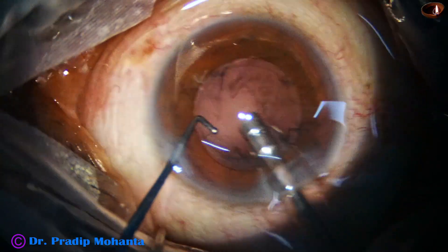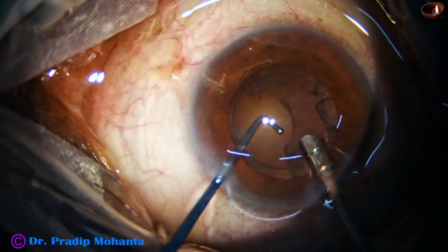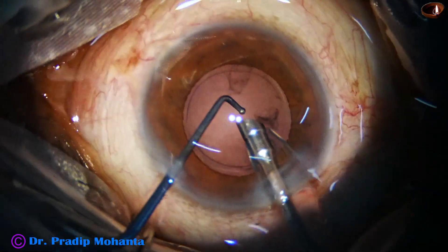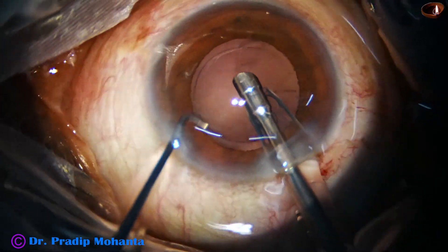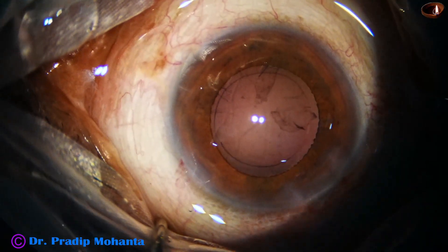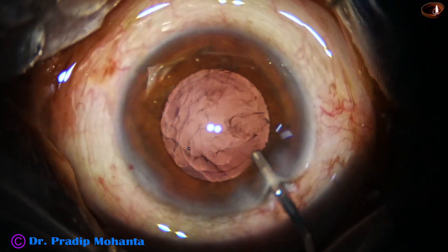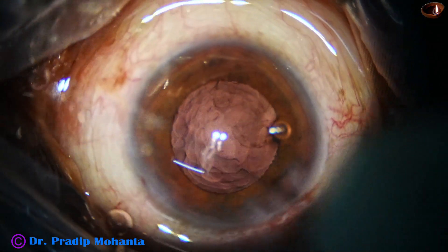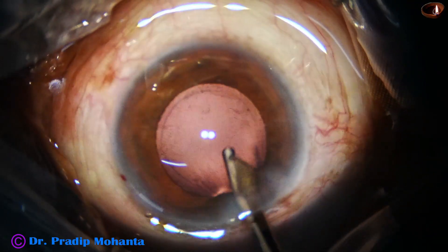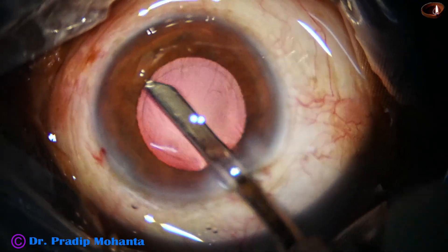And now I am trying to remove the cortex by the handpiece itself. This has some learning curve. Initially you are going to catch the posterior capsule. You must use reflux immediately to release the capsule, and you can use the ball-tipped chopper to protect the PC. You must use IUA mode and adequate vacuum and adequate flow rate should be used.